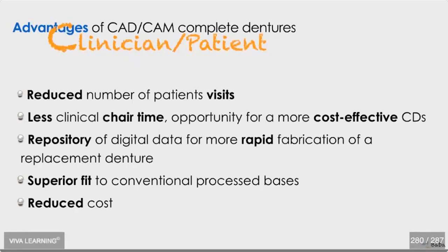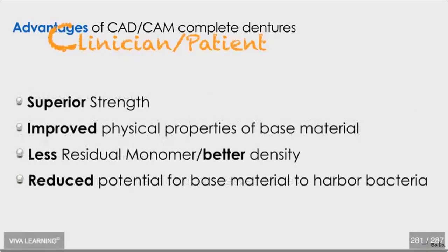Now, remember, the lab has designed your dentures virtually, so they can keep them. God forbid the patient loses their denture in a campfire, in a barbecue, or in a hospital. You just have to call the lab and have them reprint another one. Also, the dentures have a superior fit compared to conventionally processed dentures, and they have a reduced cost. Now, maybe not a reduced cost for you as a clinician, but definitely for the lab technician.